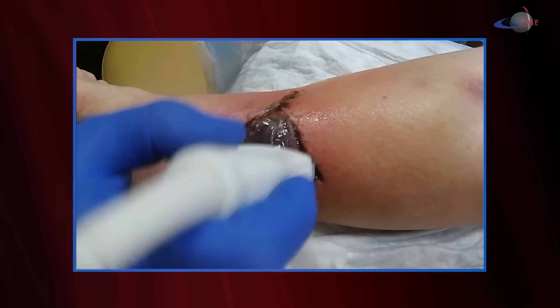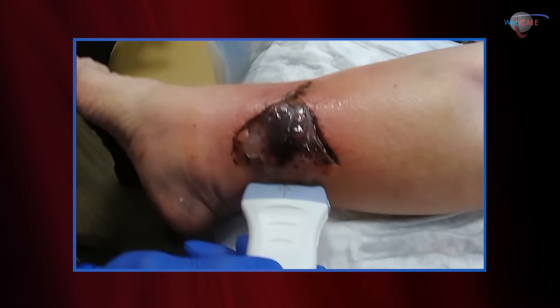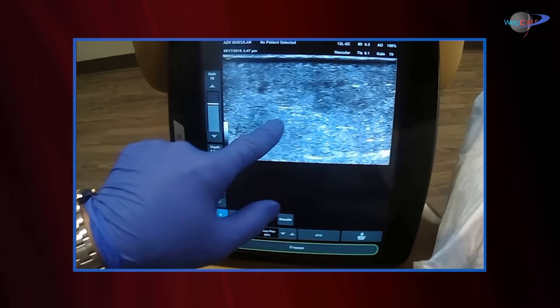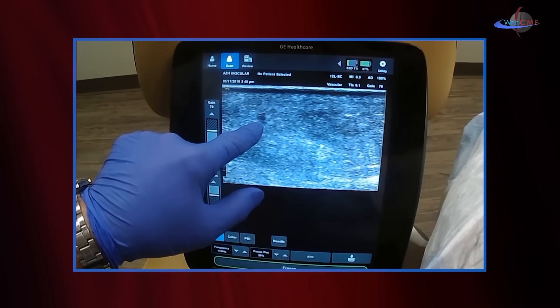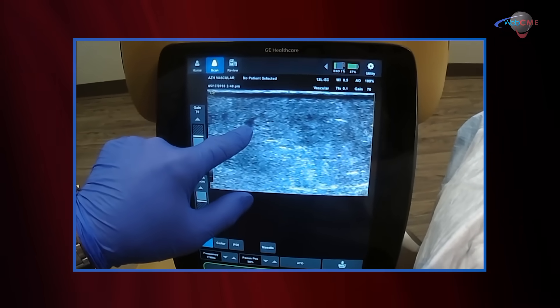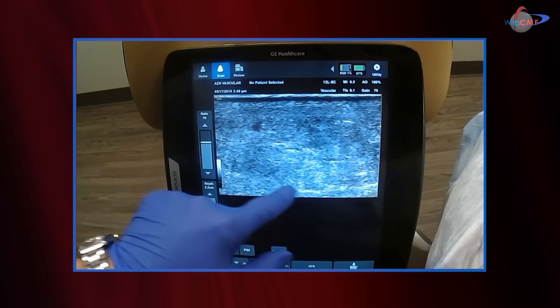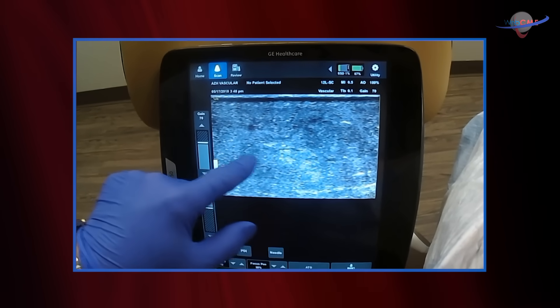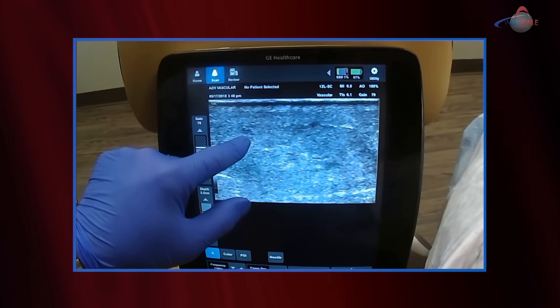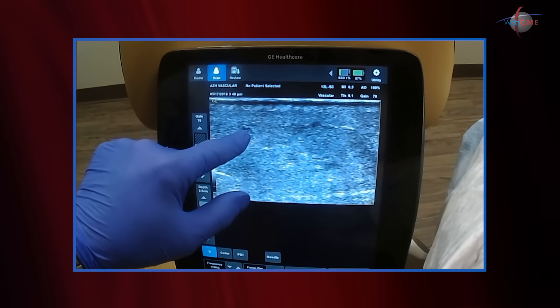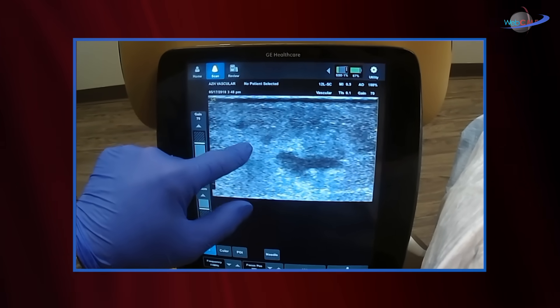First, I'm going to show you what normal tissue looks like. As you'll see, we're outside the wound base. This is normal tissue — there is a blood vessel right there. We're getting some hypo-echogenic signals from this area, meaning there's fluid in that area — fluid in the blood vessel. Here, the subcutaneous tissue, potentially some muscle and fascia down lower, is the normal appearance of tissue with an occasional blood vessel coursing through. You'll notice the echogenic changes of the tissue versus that which you see with fluid, and here again we see another blood vessel coursing through.